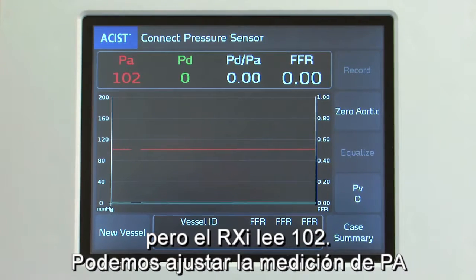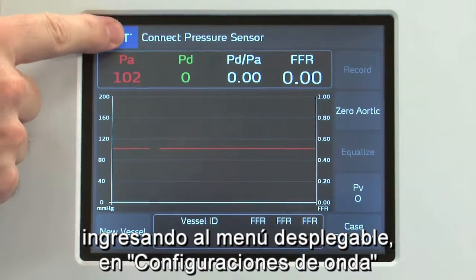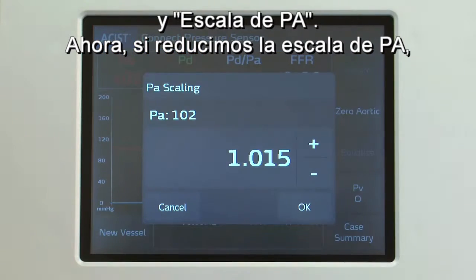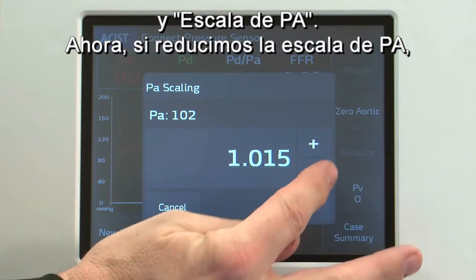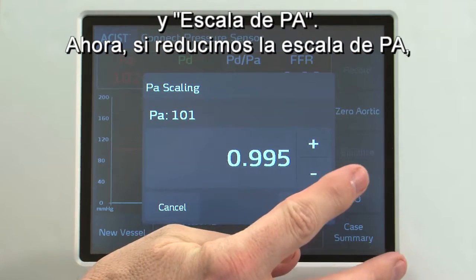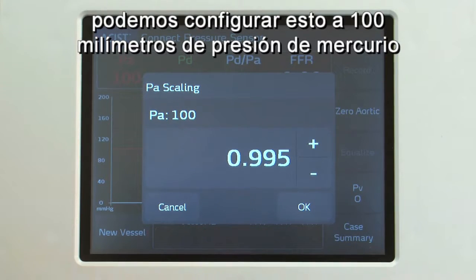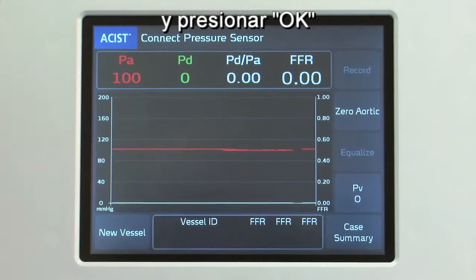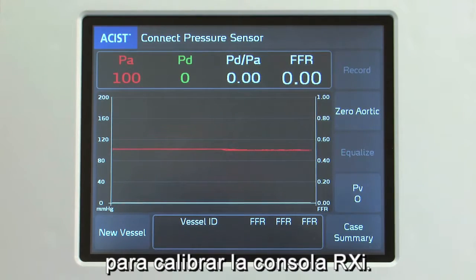We can adjust the PA measurement by going under the drop-down menu to Waveform Settings and PA Scaling. By adjusting the PA Scaling down, we can set this to 100 millimeters of mercury pressure, and hitting OK calibrates the RXi.